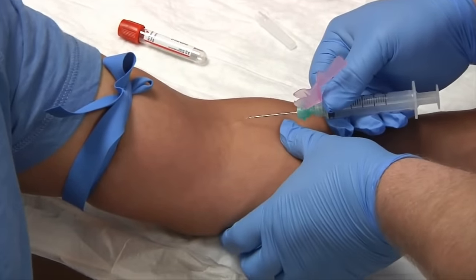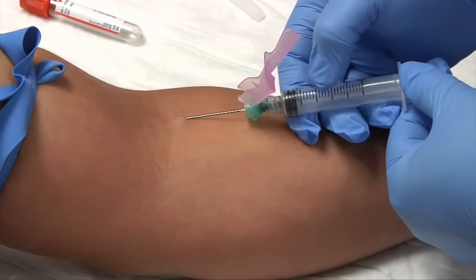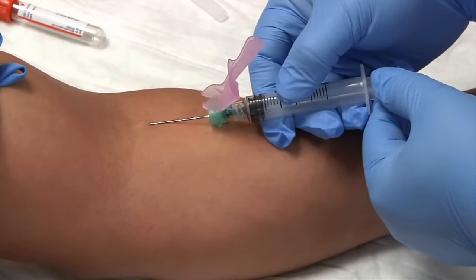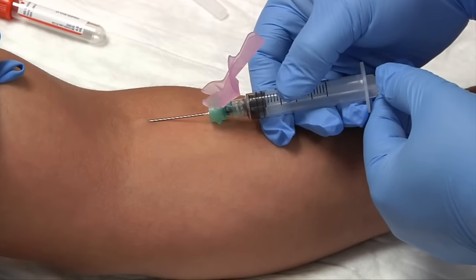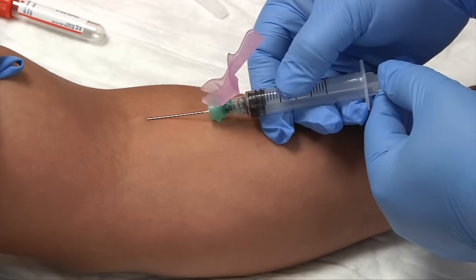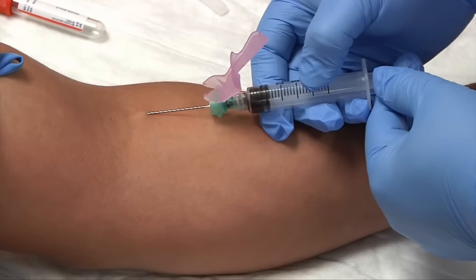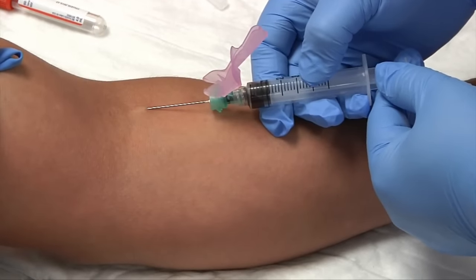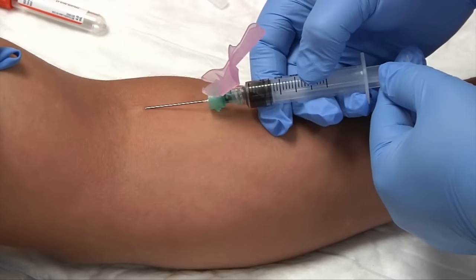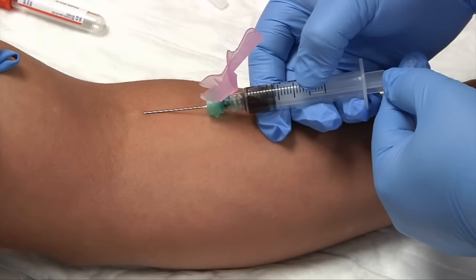Anchor your vein, and one, two, stick. Slowly pull back. For this test I'll be performing — it's a serum test — I'll need three milliliters of blood. Very slowly, I'll pull back the plunger until I have three milliliters. I can tell because my syringe is a graduated cylinder, marked on the side. You'll see the blood slowly move in. Gradually pull back your plunger — this will take a little time because our patient cannot tolerate the suction from regular tubes.